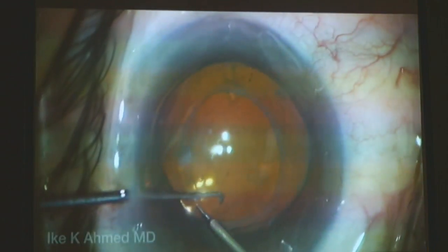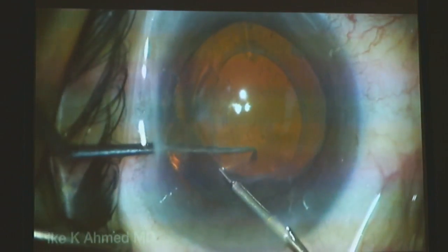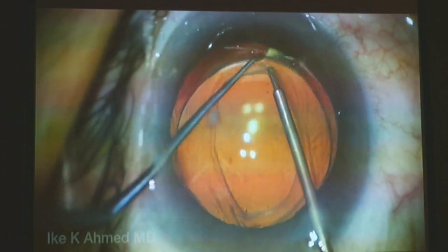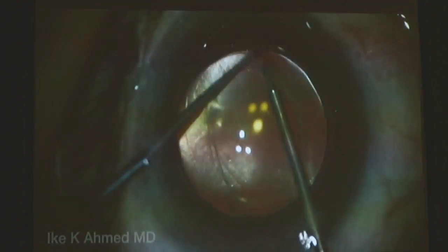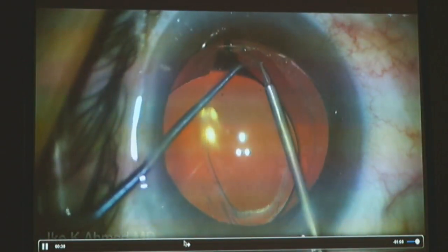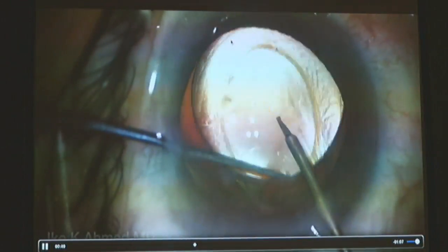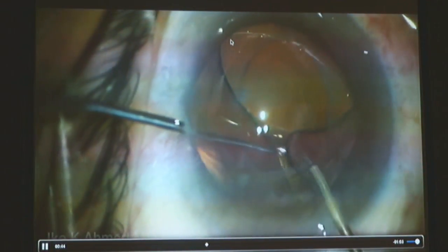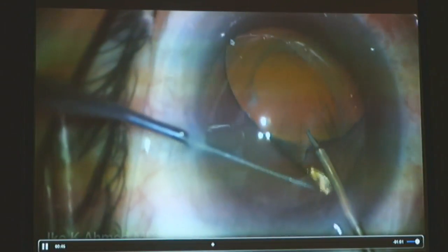There you see this. There's minimal reaction here, and by doing this, basically, we can essentially separate the lens from the capsule. And sometimes there's a bit of pushing and pulling a little bit, gently, to essentially simply release the plastic polymer lens here from the bio tissue, of course, which is the capsular bag here.